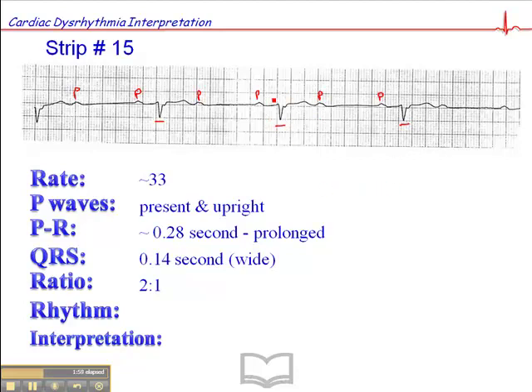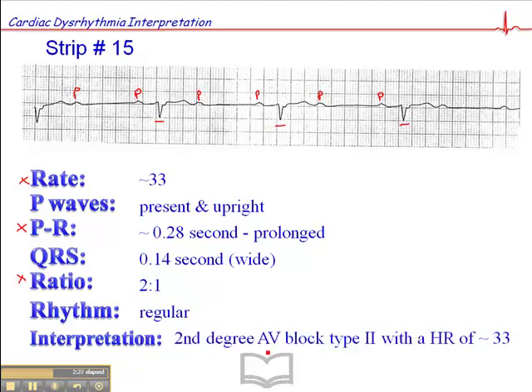Now I know this QRS configuration is a little odd and I'm going to talk about that a little later. The rhythm is regular and this is another important factor. So given the heart rate, given the fact that we have a PR interval which is prolonged, we'll give you that much, but it's consistent, that's important, and the ratio which is 2 to 1, the interpretation of this is a second degree AV block type 2 with a heart rate of 33.